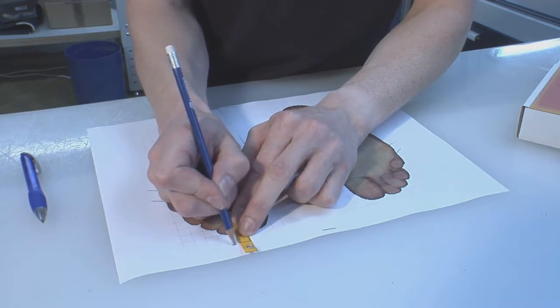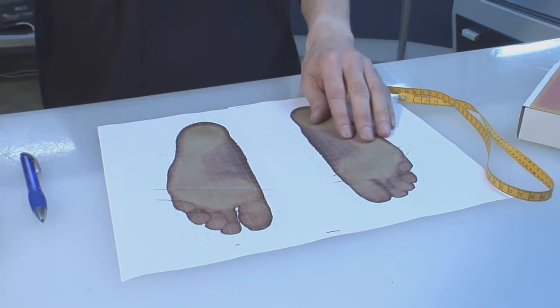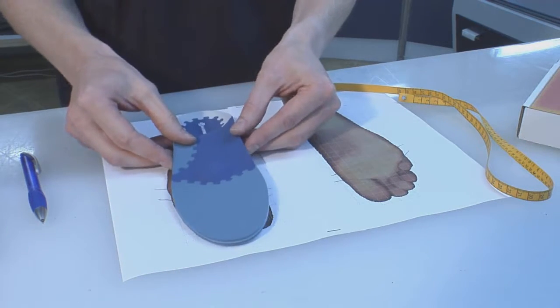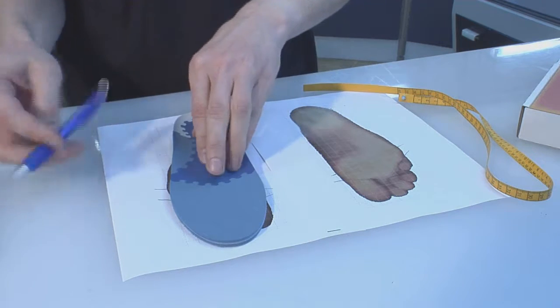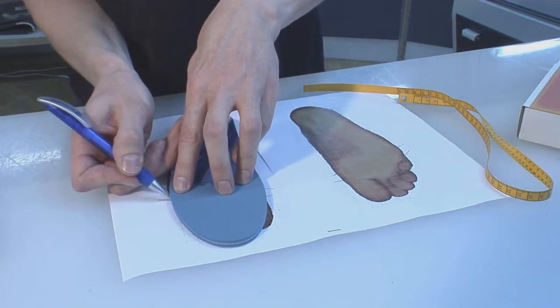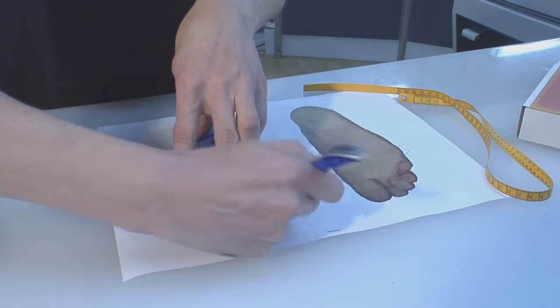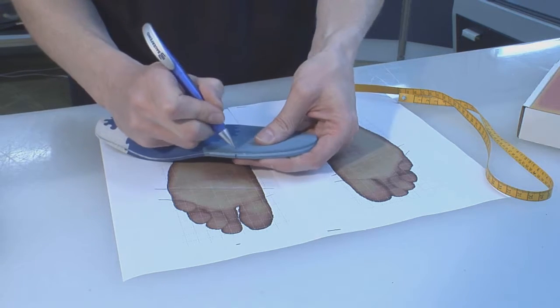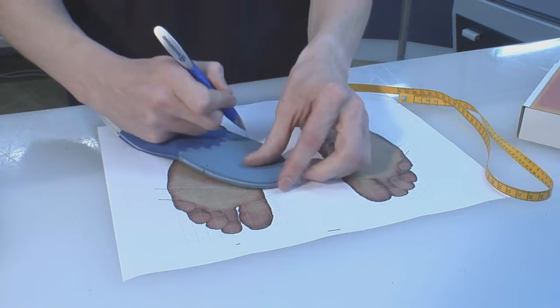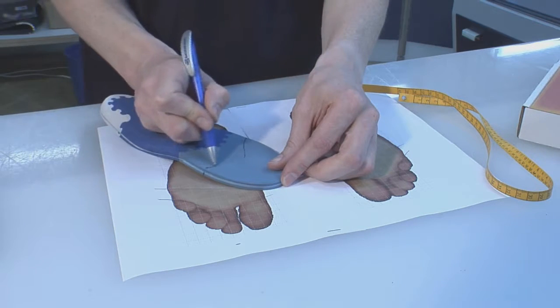The proper shoe size for athletes needs to be at least half an inch longer than the foot measured in standing position. This same criteria goes for the TRIactive. Please make sure that the transverse arch support is in the correct position. It's always possible to slightly adjust the position by grinding to meet your customer's individual needs. Now copy the line that describes the location of the toes to the insert.